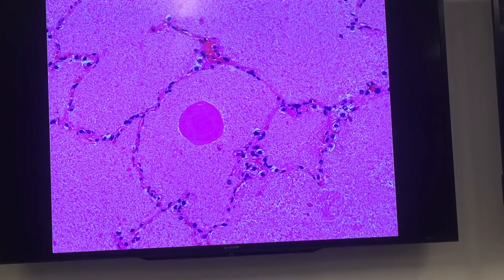And then, which of the first years? Atsuko, are you first year? Second year. So let's do first year. Ellie, describe this case. There's debris within the alveoli. There's what within the alveoli? Debris. Okay. Proteinaceous debris. Yeah.